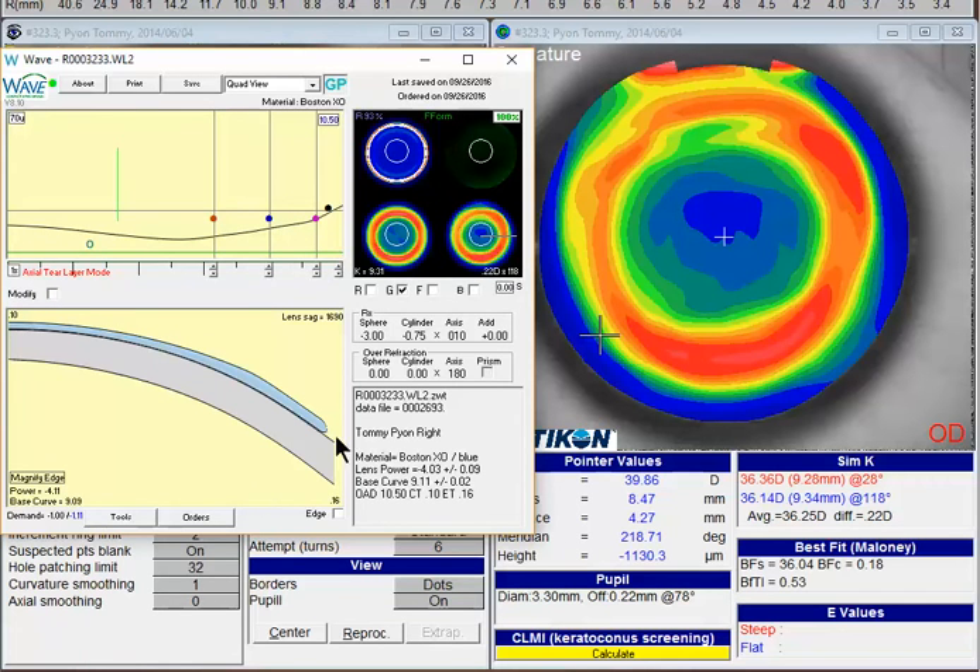And then I would switch over to freeform, which will allow you to pick up more detail all around the lens, and let that wave redesign that one. We'll give it a moment to do the calculations.